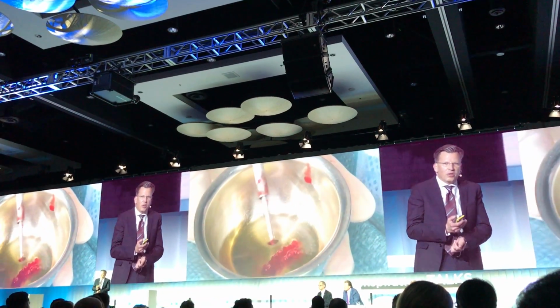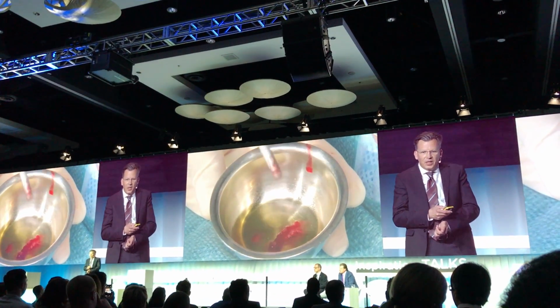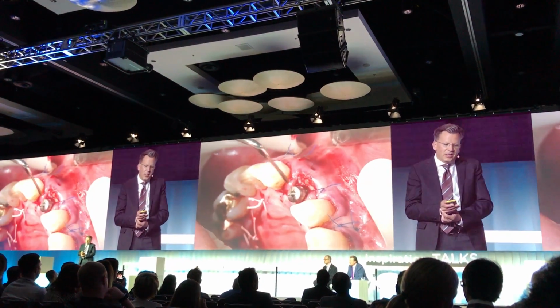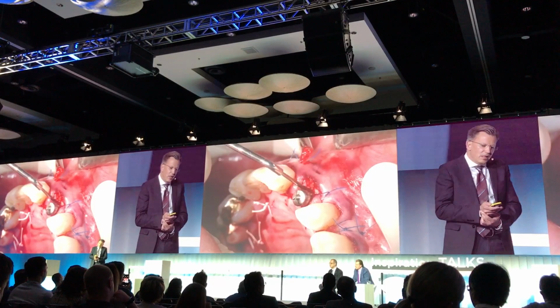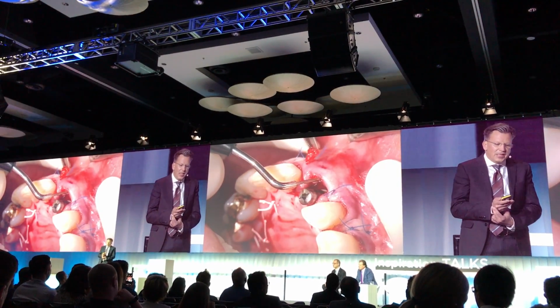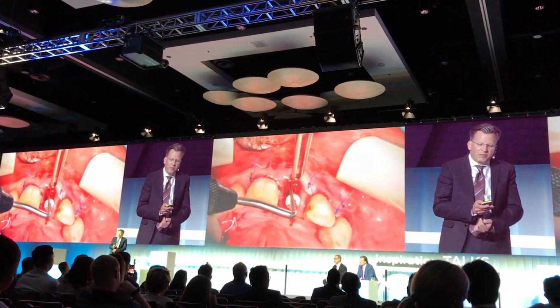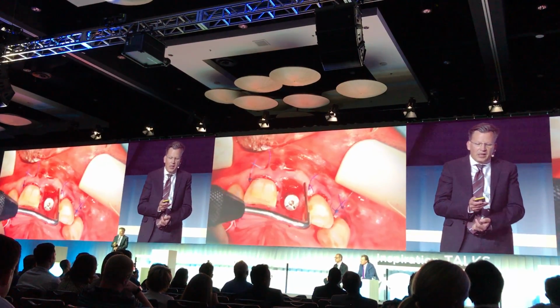We put it into doxycycline in between, and we use pluggers from endodontics, and we push away the connective tissue and place the bone graft between the implant surface and the connective tissue down to the defect under the microscope.